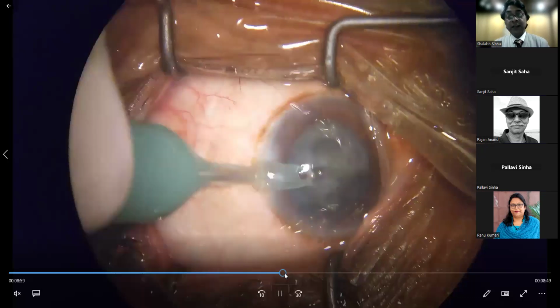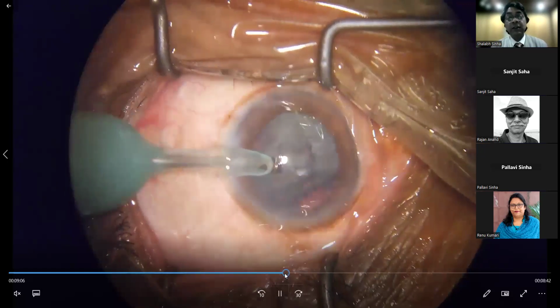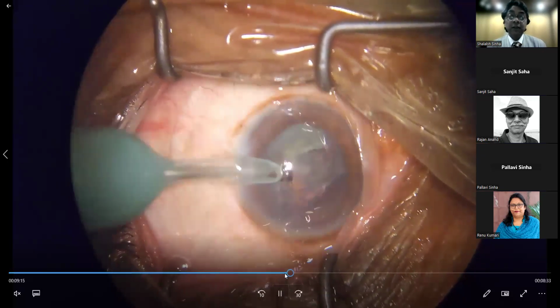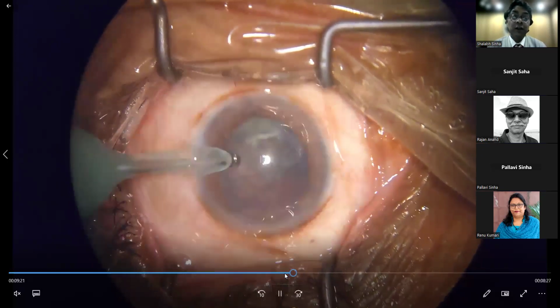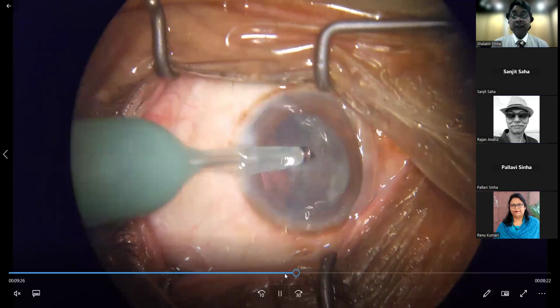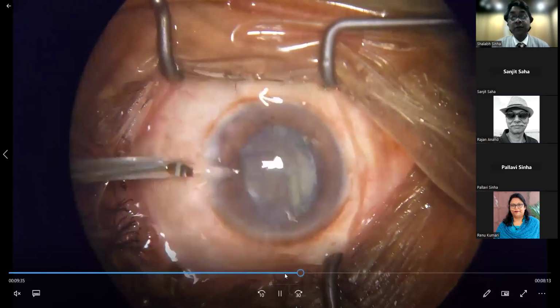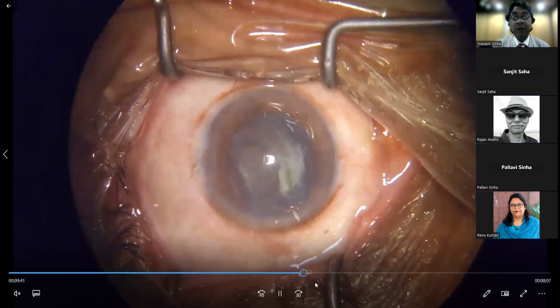So that is one trick that one can do. If the nuclear fragment doesn't come in very easily into your phaco tip, then you can inject some viscoelastic, just like you do hydrodissection. In similar fashion, one would do a hydrodissection, but using viscoelastic. So that basically creates a space between the capsule and the fragment, and allows it to come into your phaco tip.